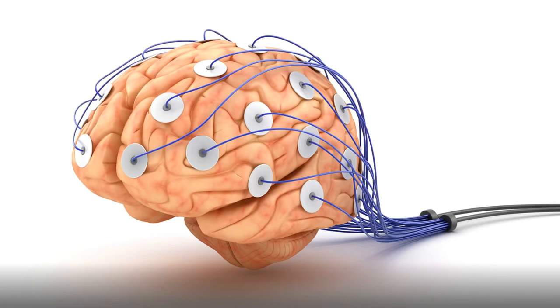The robotic arm moves the hand in the way that they thought, so they get the biofeedback and the sensation of that happening. They'll imagine something with their hand and then get that movement forced on their hand.